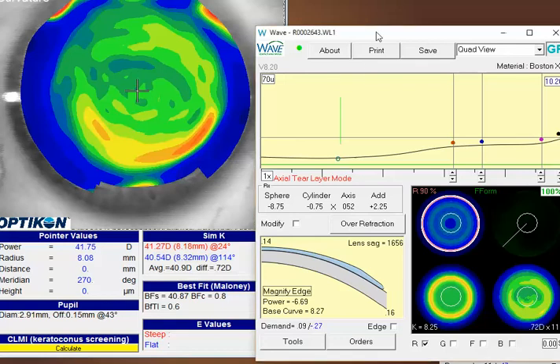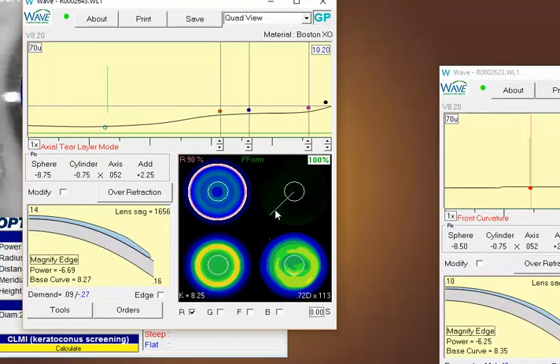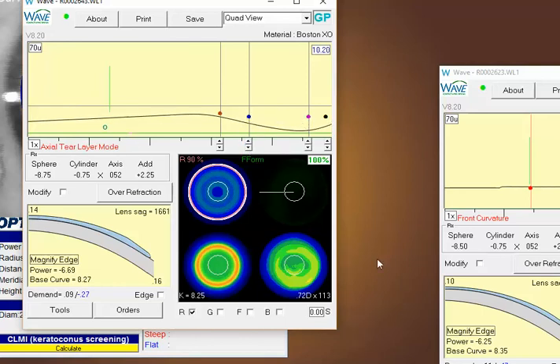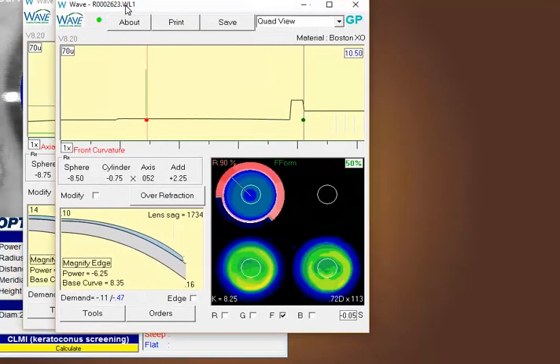So if you look at your design, I think you made some nice changes from the first to the second lens. And one option is just to still take this particular lens and just steepen up, bring down this landing zone between the blue and pink dot to try to snug that up a little bit, and that'll steepen that lens up. The other way to do it, I did a quick mock-up here.